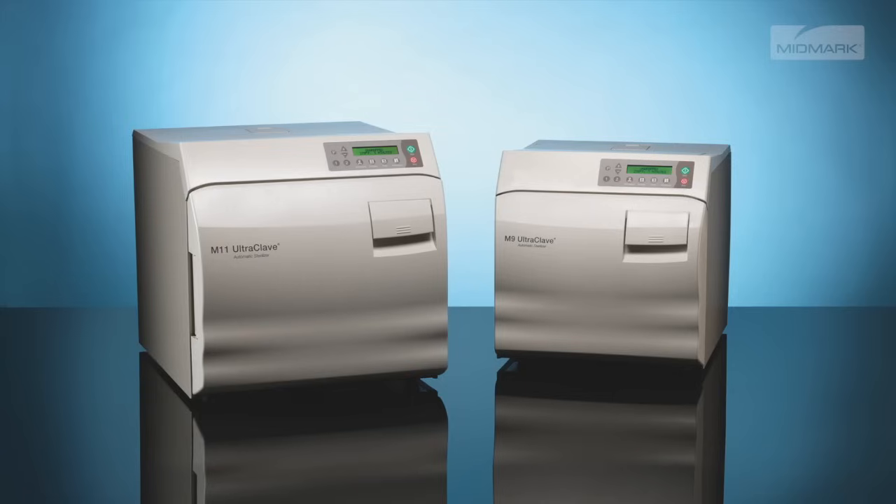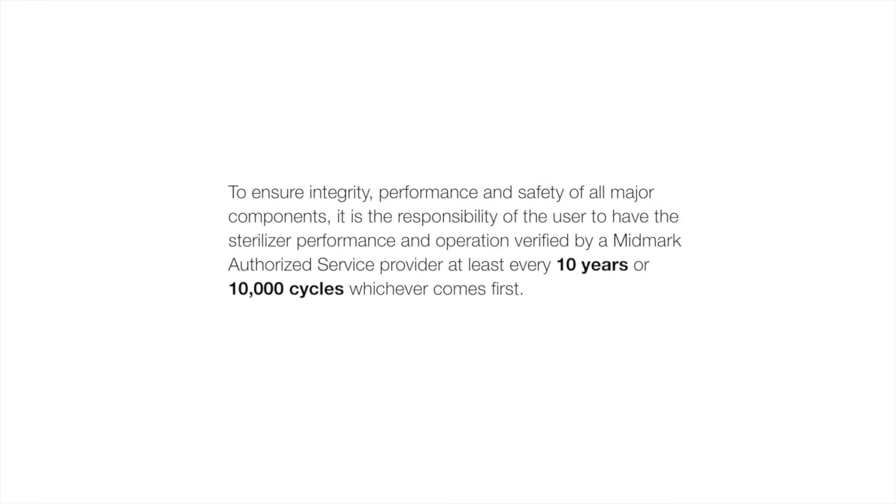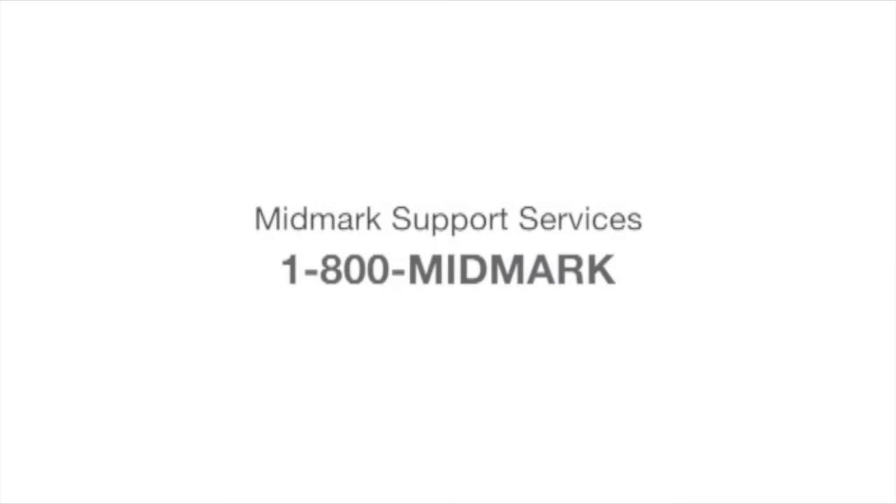M9 and M11s are designed and tested to provide exceptional reliability throughout their service life. To ensure integrity, performance, and safety of all major components, it is the responsibility of the user to have the sterilizer performance and operation verified by a Midmark authorized service provider at least every 10 years or 10,000 cycles, whichever comes first. For more detailed information about maintaining your autoclave, please refer to the M9-M11 Installation and Operation Manual. For further support, contact Midmark Support Services at 1-800-MIDMARK.